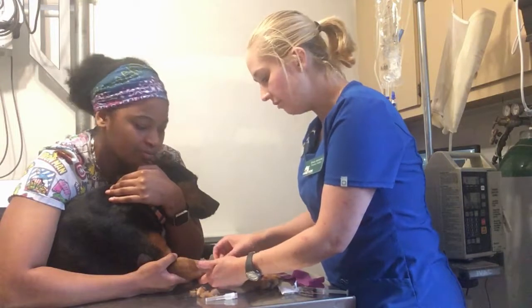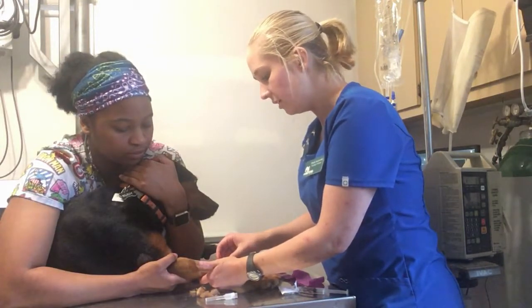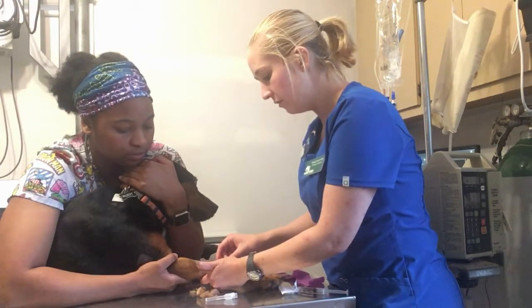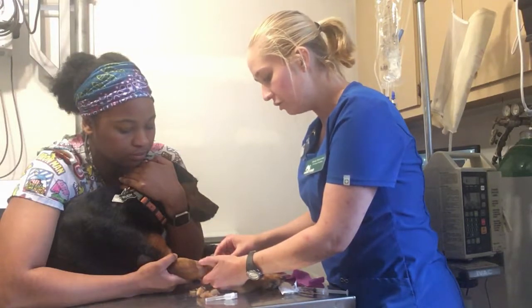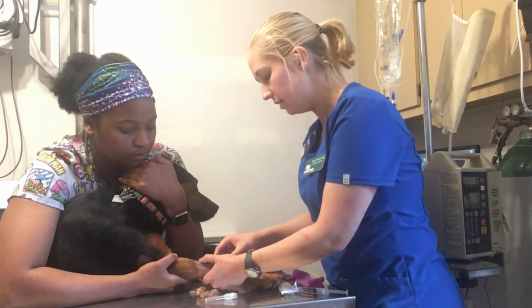Once you see a flash, you can very gently thread the catheter through the vein, making sure that you're still getting a flow of blood.